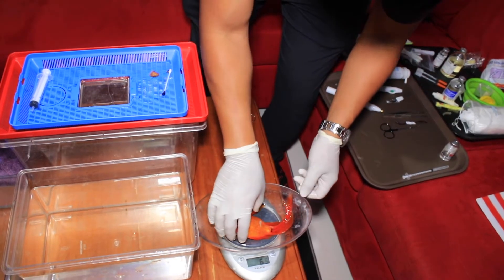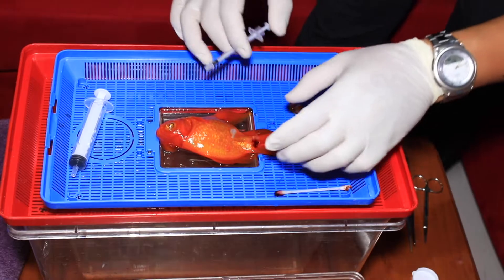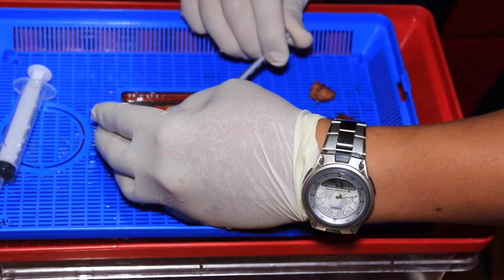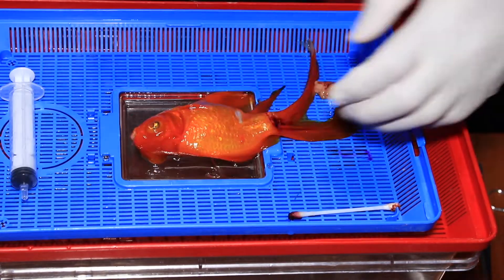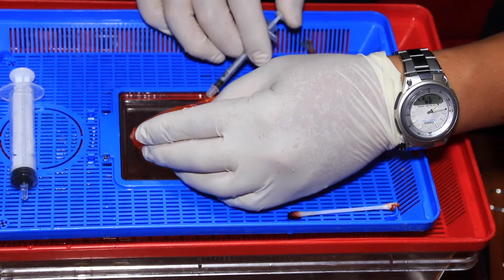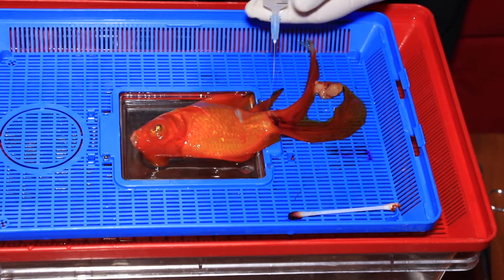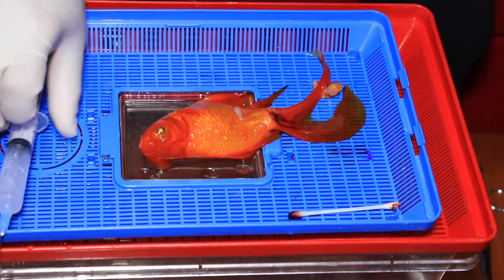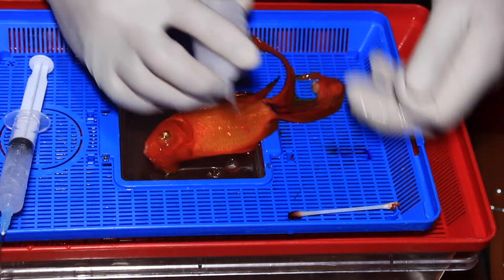Golly weighs 65 grams and the other fish is 340 grams. Injecting pain relief — flunixin at half a milligram per kilogram body weight — into the musculature at the base of the pelvic fins. The second injection is enrofloxacin to provide antibiotic coverage because of the large wound that's been created.